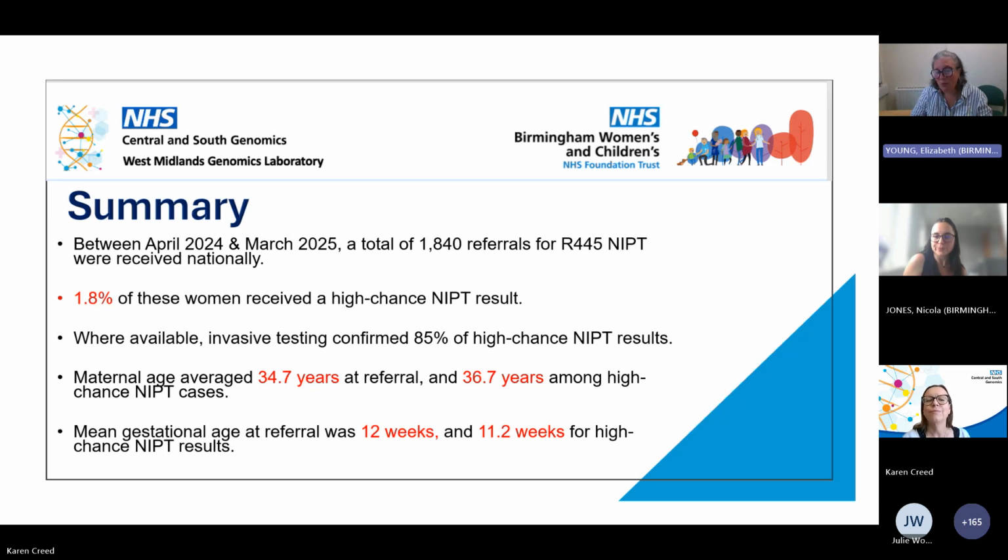Yeah, and what we do find, sorry, I'll introduce myself properly in a minute. I oversee the NIPT service here in Birmingham. What we do tend to see is a higher percentage of false positives in trisomy 13 and 18, and that's partly due to the test, but more often due to confined placental mosaicism. So that will fit in really nicely with what I'm going to show you in the final part of the presentation. So it was just an observation from an NIPT person.